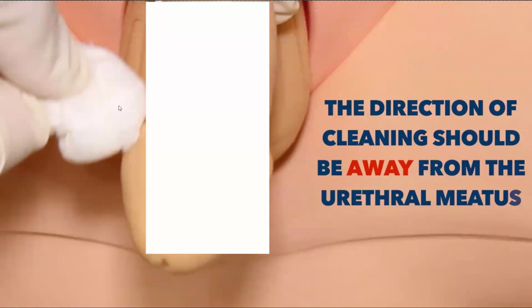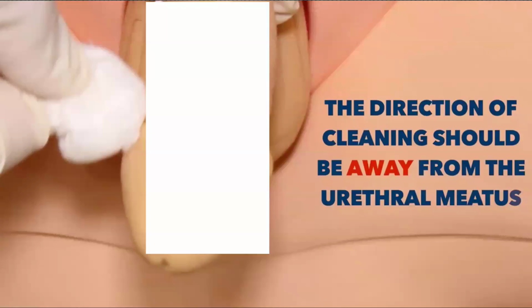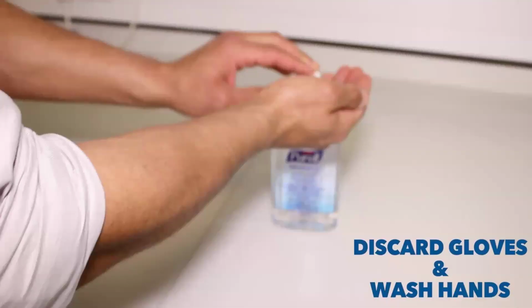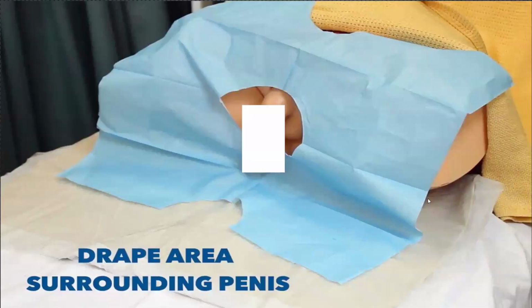Clean away from the urethral meatus, and after finishing cleaning, you will dispose of the gloves and wear another pair of gloves. Then you can cover the genital area from below and above with drapes, draping the area surrounding the penis.